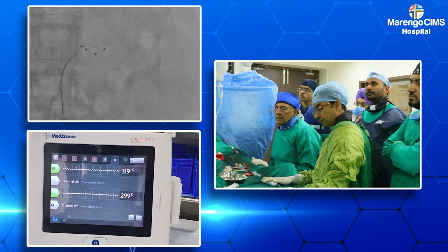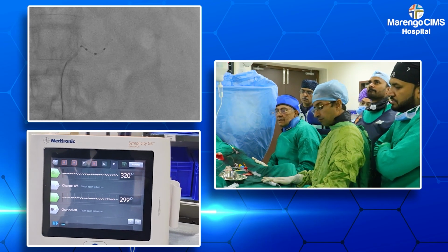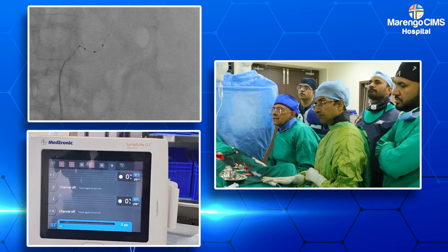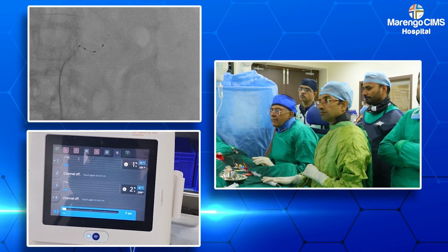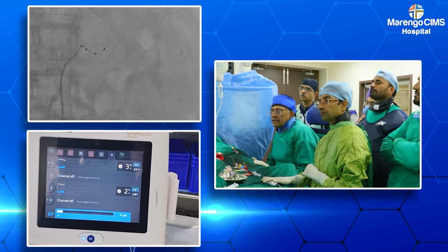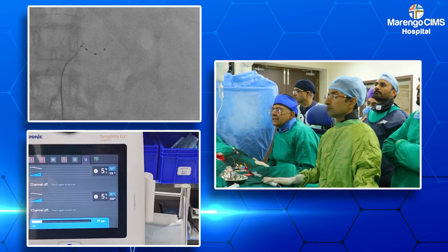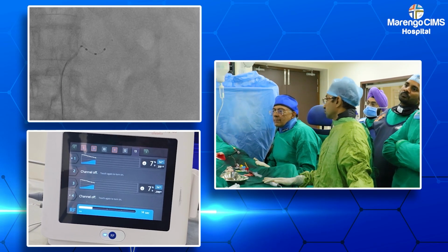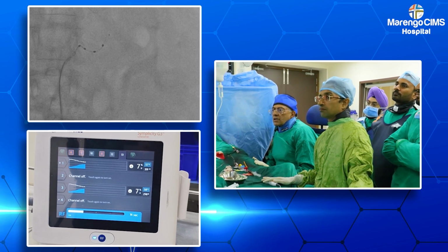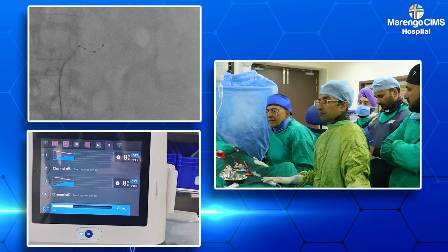Okay. Pressure is dropped, flow is low. We have Dr. Niren Bhavsar. He is senior most director of our cardiac anesthesia department. He has been supervising the entire pain management. Pain management is an extremely important part of this procedure where pain management should be very adequately done.